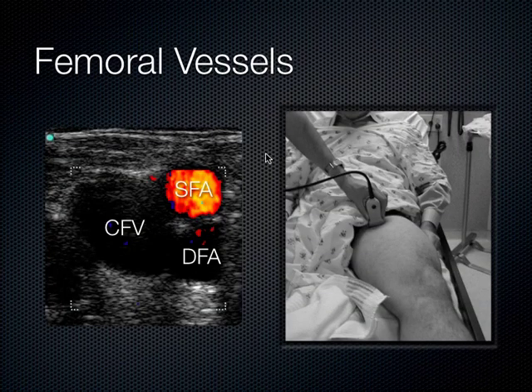So this is what it looks like. So let me ask you guys a question. Knowing full well that the indicator goes to the patient's right, this is a transverse view of this patient's common femoral vein, superficial femoral artery, and deep femoral artery, okay? Let me ask you something. Just based on this, knowing that Venous is more medial, Venous penis, which leg is this, the right leg or the left leg?